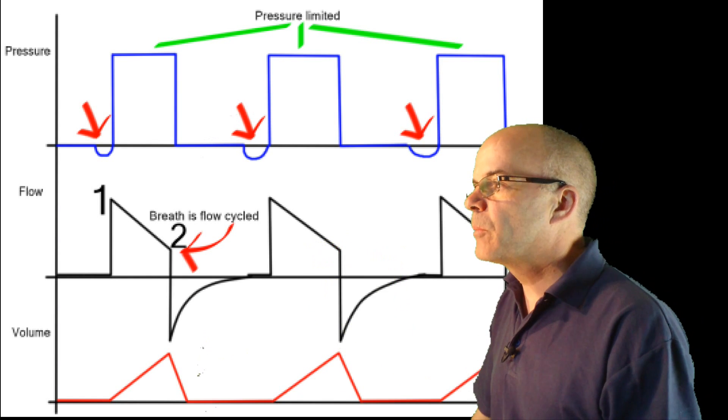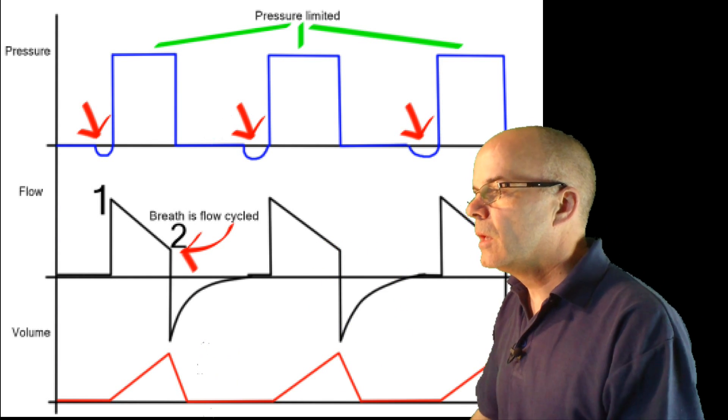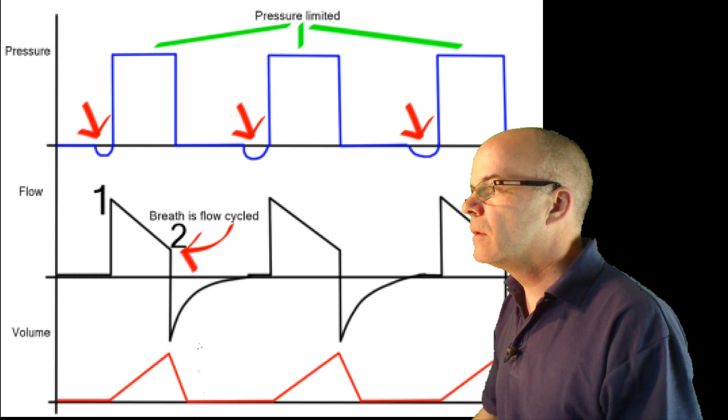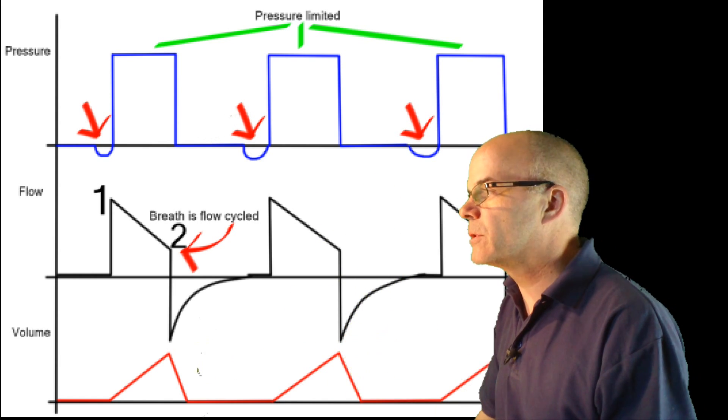This is the information from a pressure-supported breath. We have the pressure generated at the top, the flow generated in the middle, and the subsequent volume at the bottom.